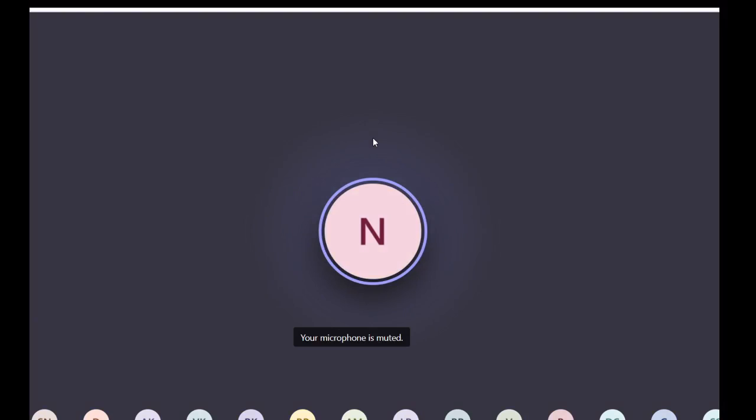Now what we use is positive pressure ventilation. Even in a mechanical ventilator or in non-invasive ventilation, what we do is we give a positive pressure into the lungs of the patient.